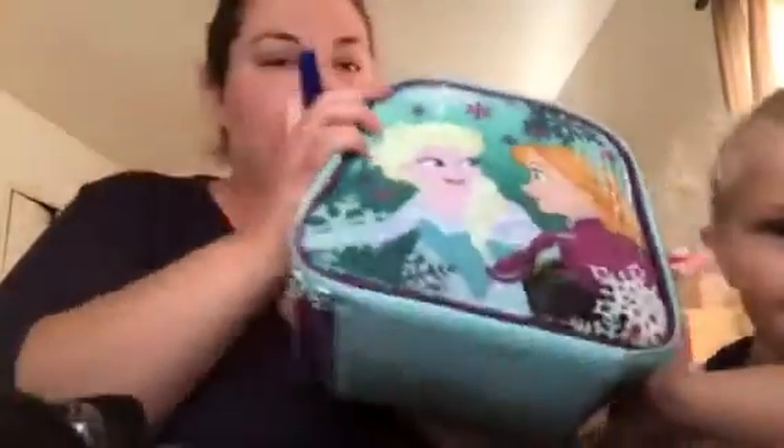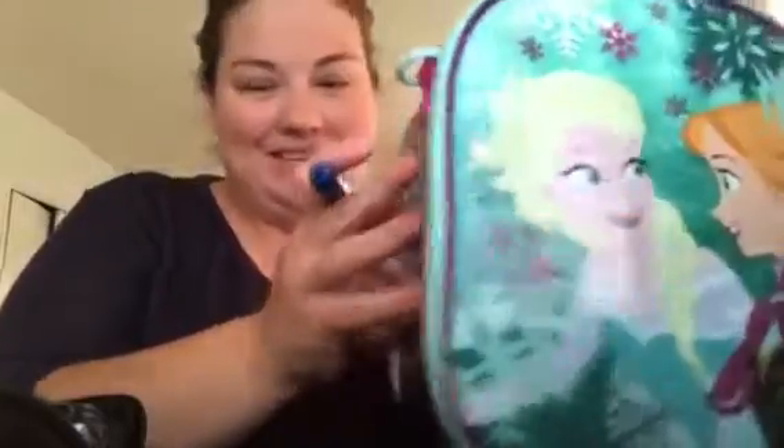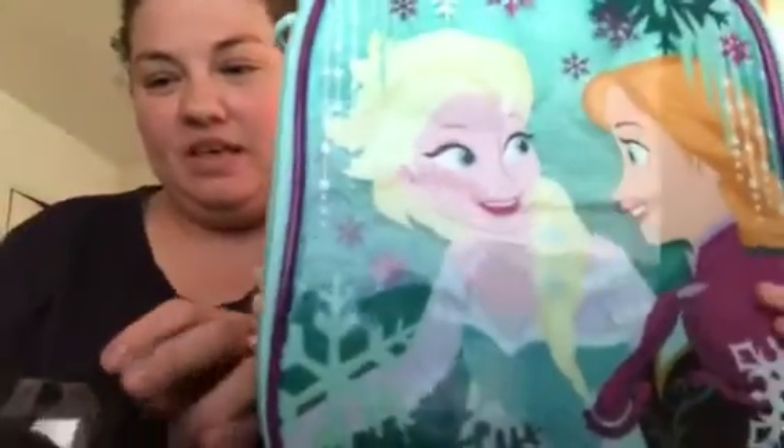After that I make sure to clean. I just clean off the tip of this to make sure that if any blood got on there, it's not gross. She's showing them her Elsa and Anna band-aid. And then I put all of her supplies away. Say bye to our friends, because you were so brave on the video. Bye, friends!